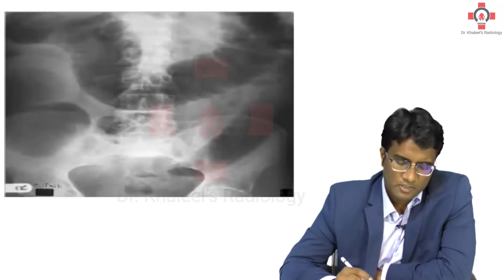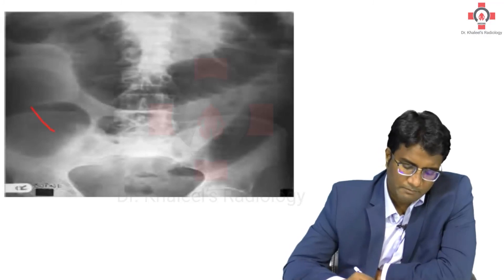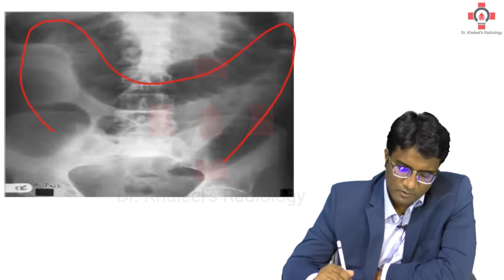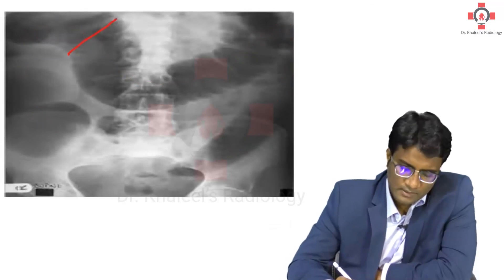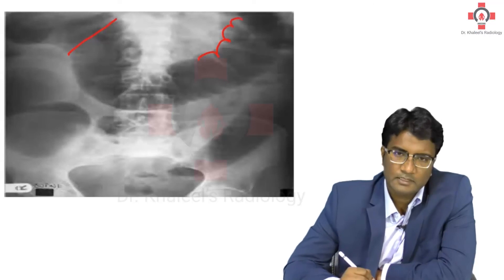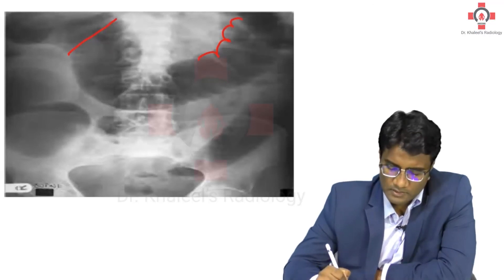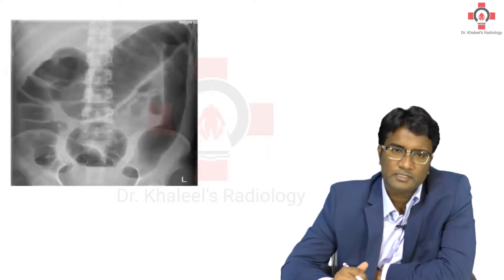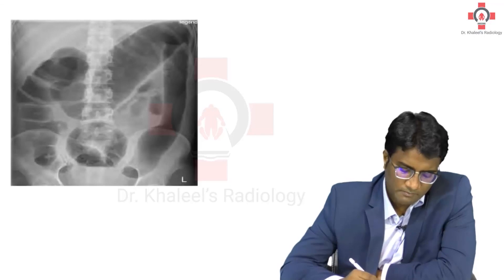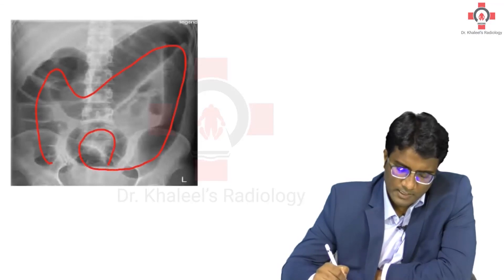Now, is this small bowel or large bowel? Identify the peripheral location — the bowel loops are of very large diameter and you can see haustra markings. All of these features suggest large bowel obstruction. You can see peripheral loops, dilated bowel loops, and haustra markings.